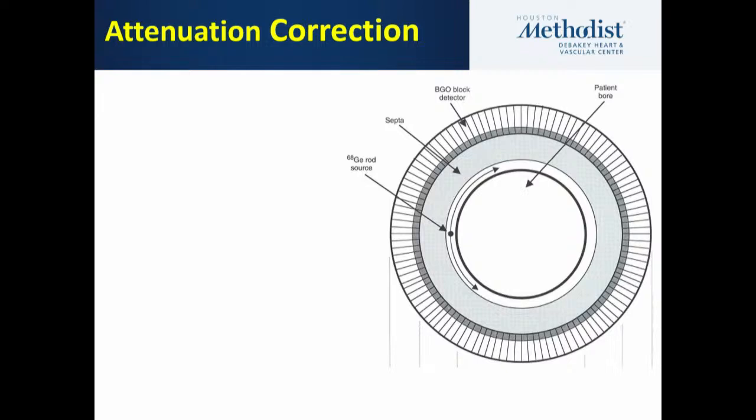The other one has to go all through your body, all the way to the back, and then go in the air, go through the table, and hit the detector on the other side. So one of the aspects is that while each one of them is going to travel different distances through different tissues, while they're contributing to the same image, each one of them became attenuated at a different time. So some of the ways to account for that is to look for attenuation correction.